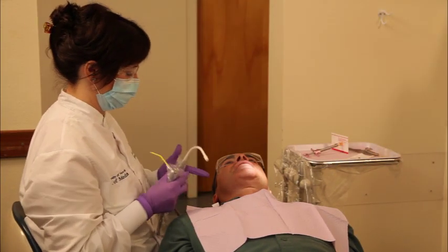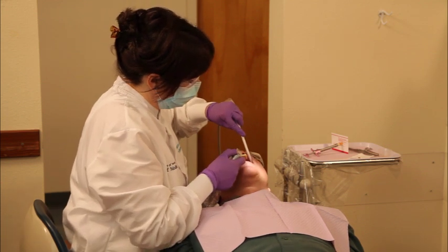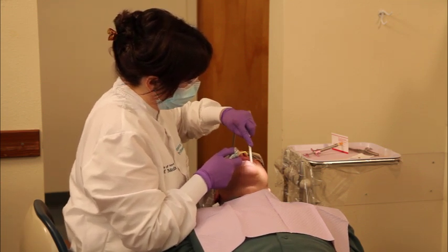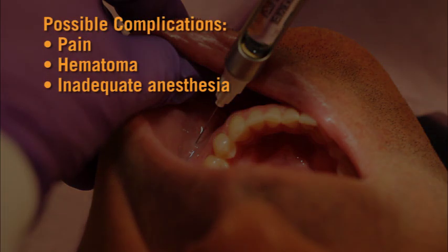If only soft tissue anesthesia is necessary, do not apply pressure to the foramen, and only the mental nerve will be anesthetized. Complications with this injection include pain if the periosteum is contacted during the injection, hematoma, or inadequate anesthesia due to injection of an inadequate volume of anesthetic into the mental foramen. In addition, inadequate anesthesia could result from crossover innervation from the mental incisive nerve from the contralateral side, in which case a supraperiosteal injection over the mandibular central incisor of the contralateral side may be indicated.